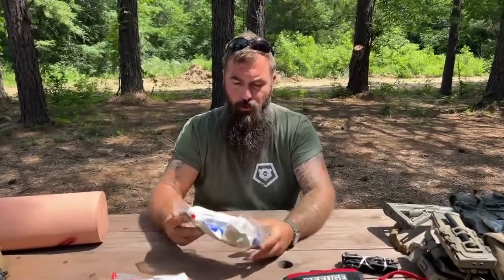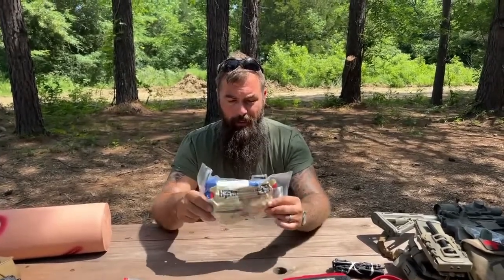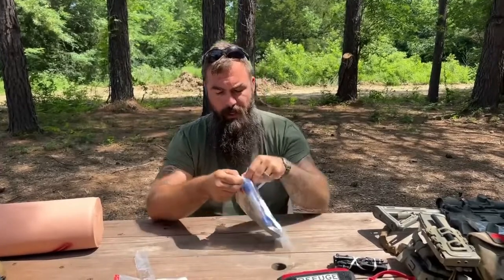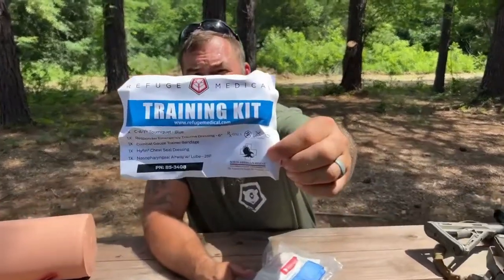So let's talk about wound packing. This is a trainer kit. When you come to refuge training — you can go to refugetraining.com, national tour dates are up — when you come to refuge training, you get one of these to keep. I'm going to tear this open because I need the pressure bandage and the packing gauze inside. It has a zip-top bag. These are all North American Rescue components in here — industry leader in trauma medicine components.